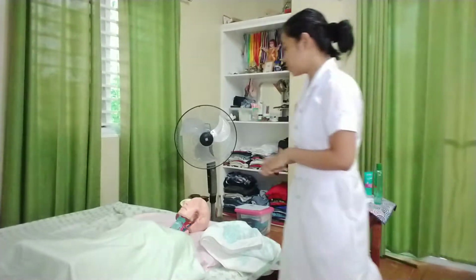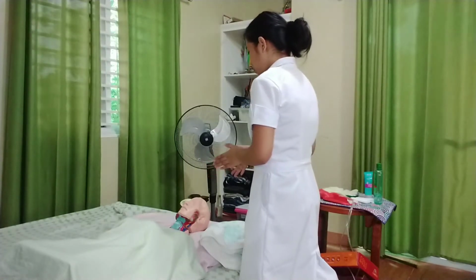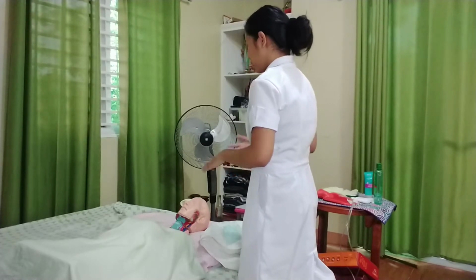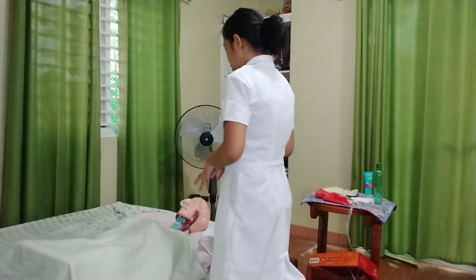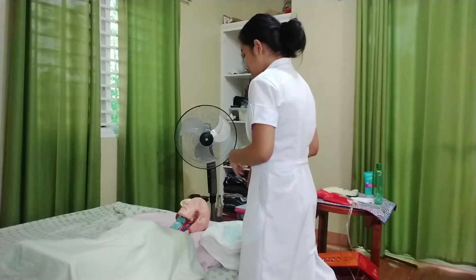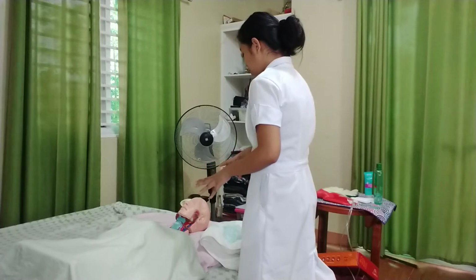So, good morning, ma'am. I'm Principal, your student nurse for today. Would you mind if I ask your name? Okay, how about your age? Okay, ma'am, that's good. So, for today po, I will be administering an enema in your rectal area. This is to stimulate stool evacuation and to relieve severe constipation. Also clean the rectal area.